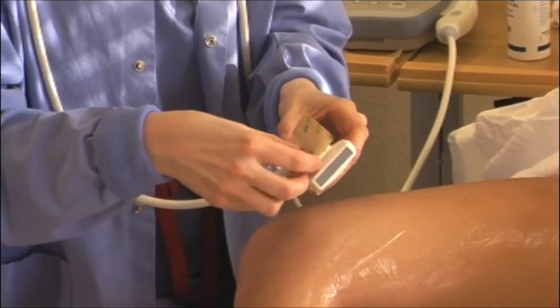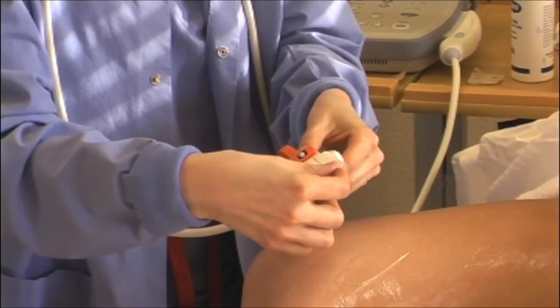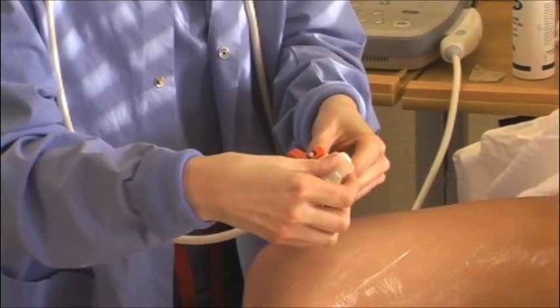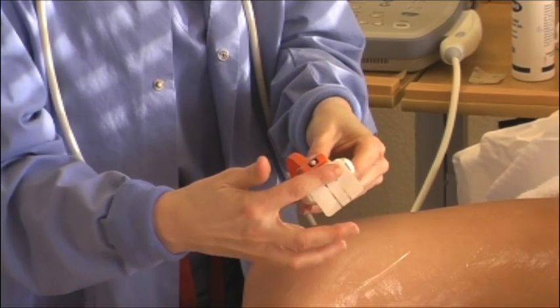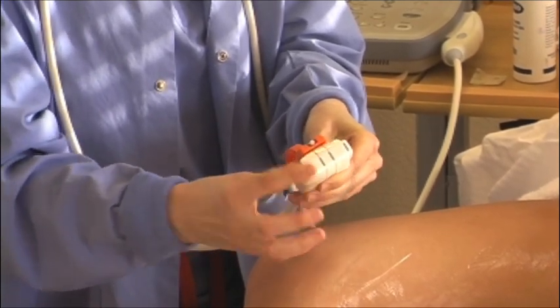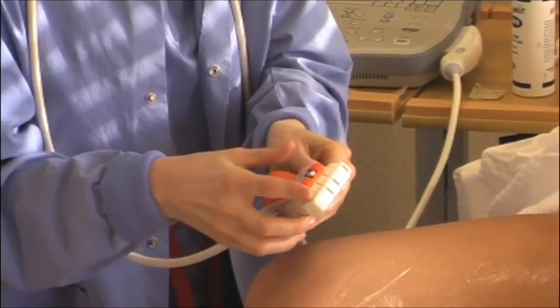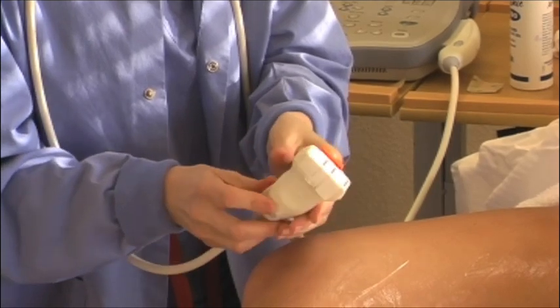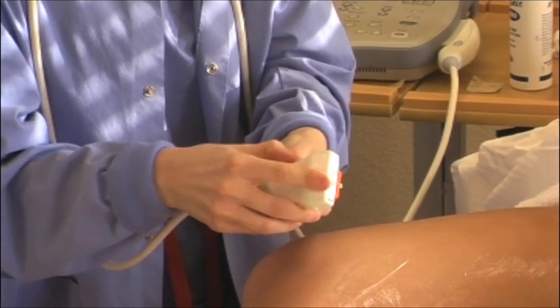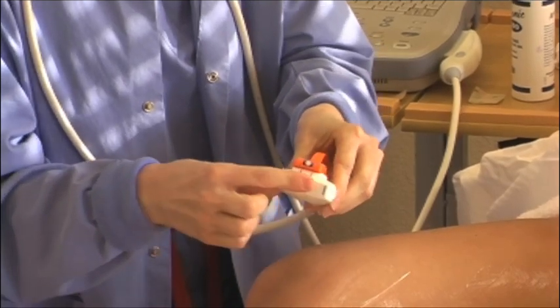Apply the shadow guide first to remove the paper backing. Pull the shadow guide across the scanning surface of the transducer. Firmly adhere the shadow guide to the transducer by smoothing it onto the transducer as shown. Ensure that there are no residual air bubbles present in the shadow guide on the scanning surface of the transducer. If so, remove the shadow guide and reapply as needed.